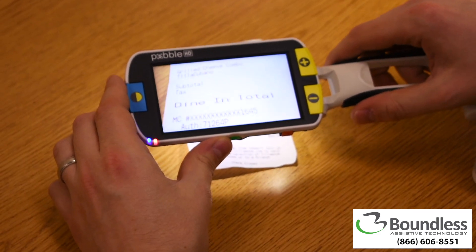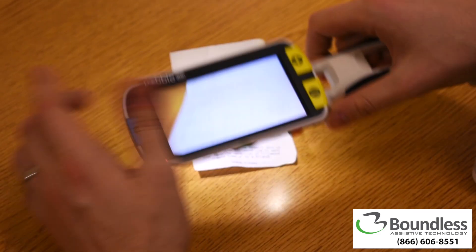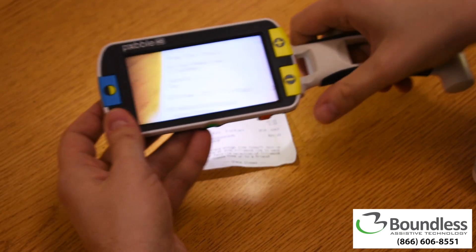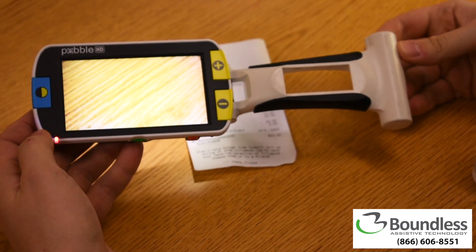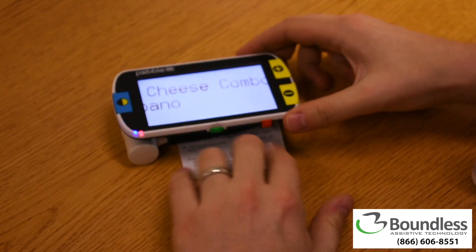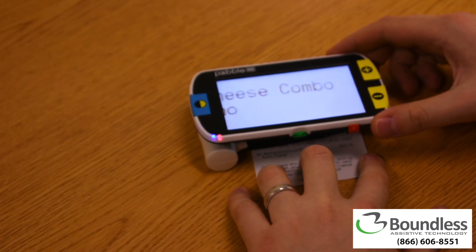What makes the Pebble most unique? Its handle is easy to grip and can be adjusted for different uses. For example, the handle has a hole in it so that the device can be rested on a reading surface. You can then drag it along as you read.